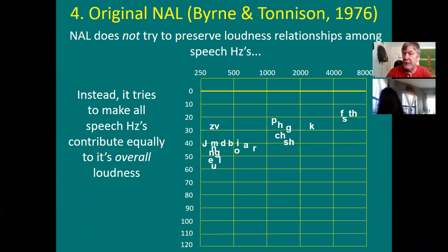Screw it. We've decided we're not going to do that. So, read what it says here. NAL does not try to preserve loudness relationship among speech frequencies. Instead, it tries to make all speech frequencies contribute equally to the overall loudness of speech. So they take a different approach.